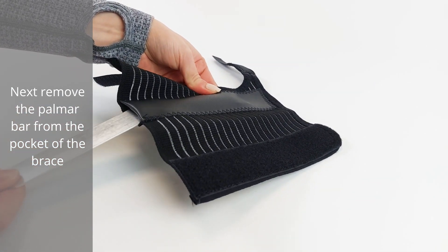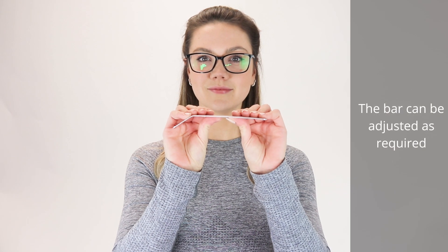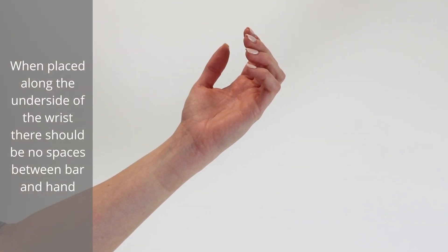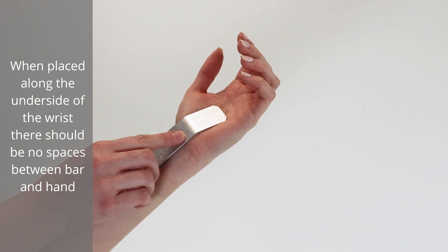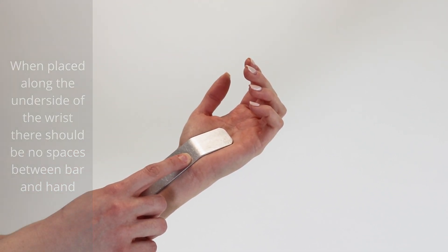The bar can be adjusted as required. When placed along the underside of the wrist, there should be no spaces between the bar and hand.